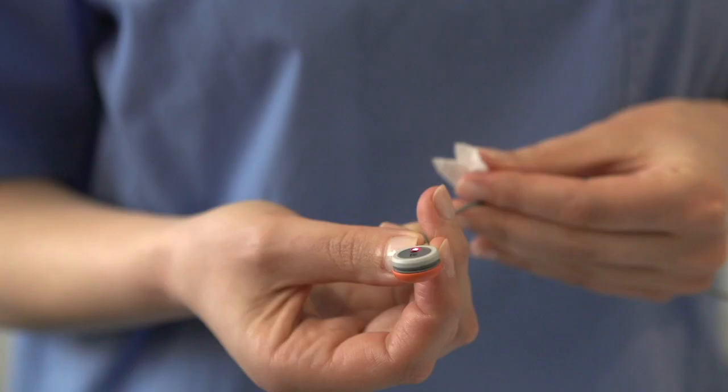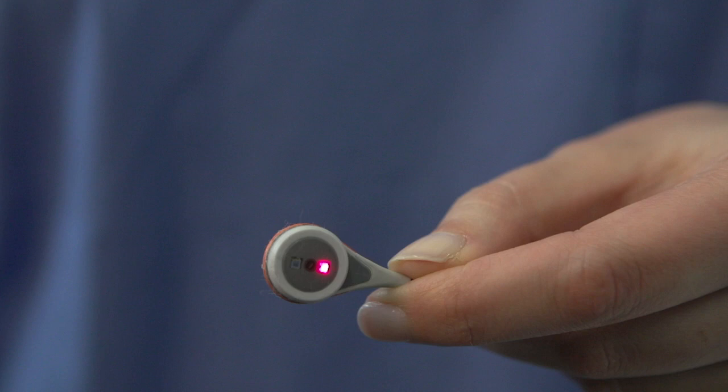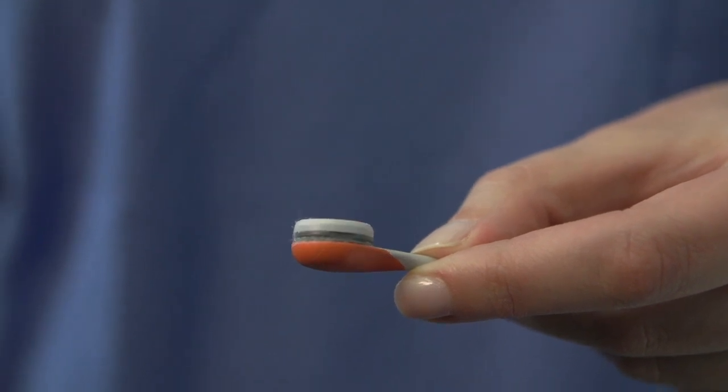After cleaning the sensor, visually inspect the sensor head, cable, and membrane. First, ensure that there is no remaining dried gel or lint residue on the sensor head or membrane surface, which may result in an unsuccessful calibration.